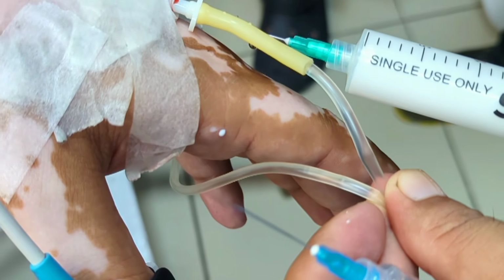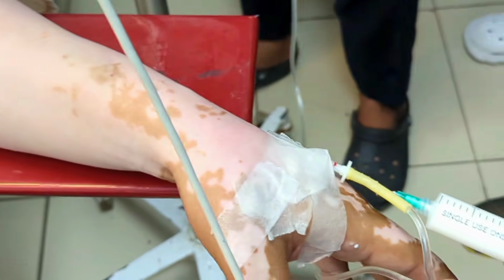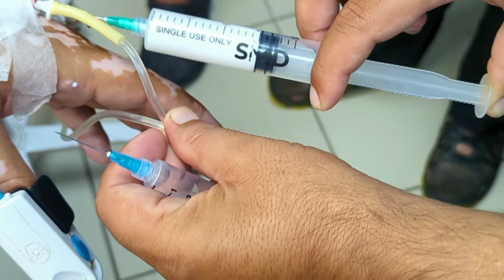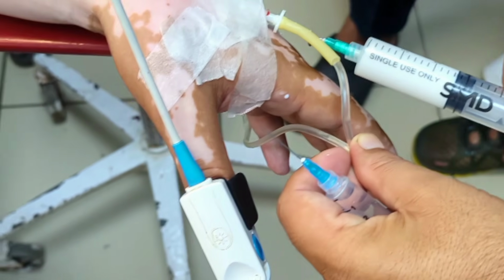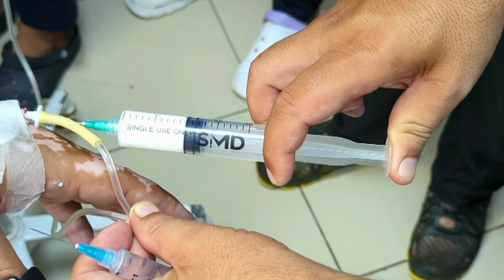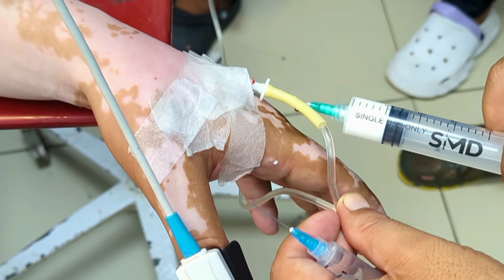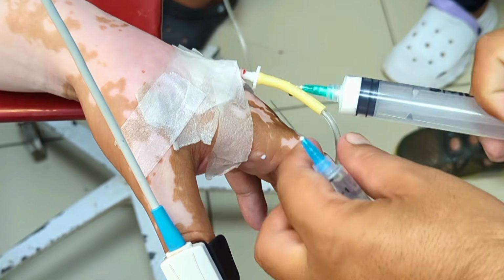Induction agents are medications that bring the patient smoothly from an awake state to unconsciousness. They act rapidly and ensure that the patient does not experience pain or awareness during the surgery. After induction, a muscle relaxant was also given. The muscle relaxant serves two purposes. It helps in suppressing any involuntary movements and, more importantly, it facilitates the process of intubation by relaxing the muscles of the airway. Once the drugs were administered, the patient's level of consciousness and muscle relaxation were checked.